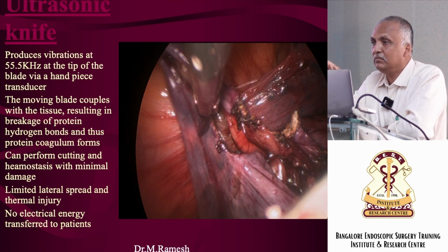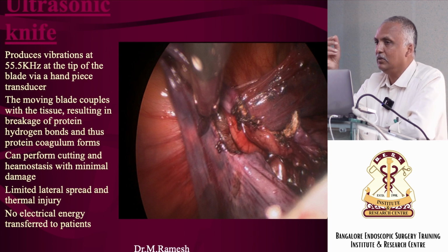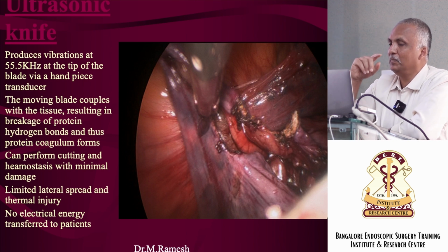Which is safer? How is it safer? It's higher heat. Hot. If it causes any damage, we won't be able to recognize it immediately in the surgeries. Which one? In harmonic. Even the complication profile, bipolar is relatively safer. No. The reason you are giving is not right. You are telling the right answer.